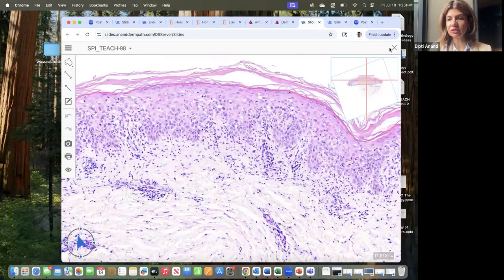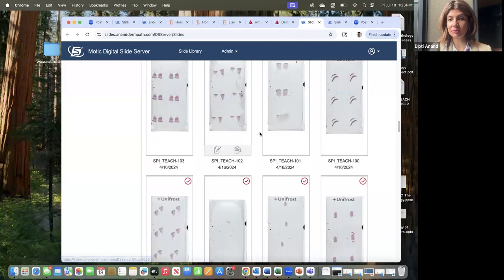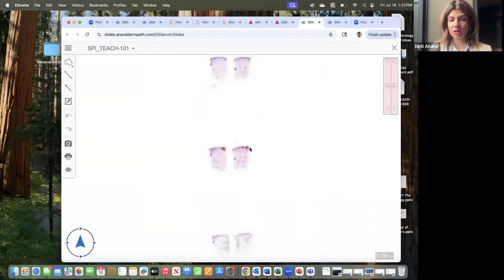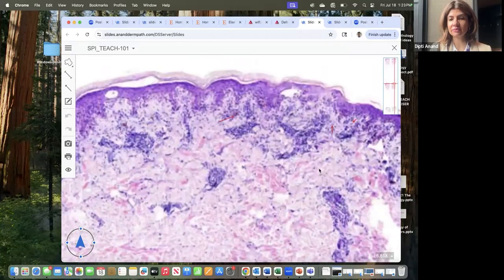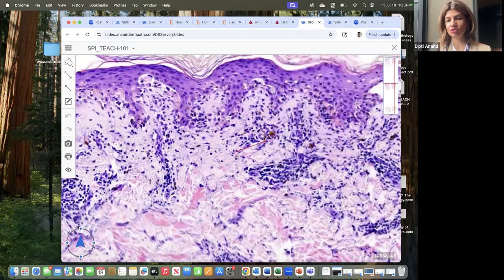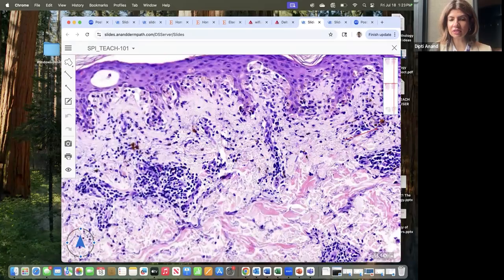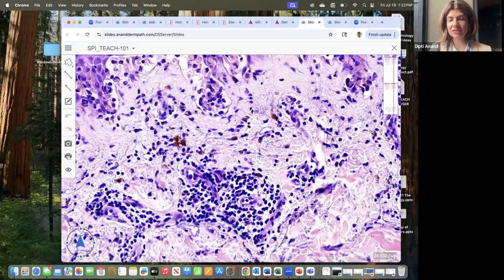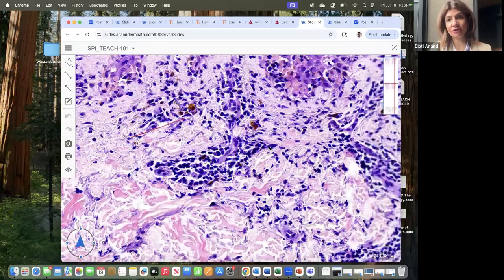Now, the way you will distinguish it is you will want to look at the degree of your pigment dropout. Okay, so if you're seeing a substantial, easily recognizable pigment dropout, like what you see in here, along with eosinophils, more than the eosinophils, you can see a couple of eos in EM, it's the pigment dropout. If you see prominent pigment dropout and you're seeing eos, then for sure you're dealing with fixed drug eruption.